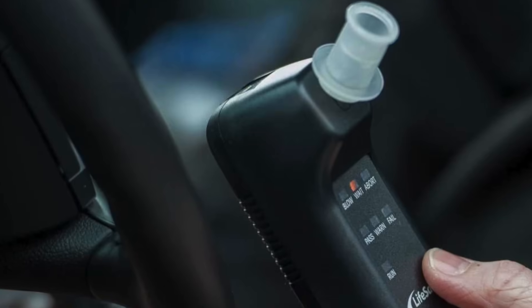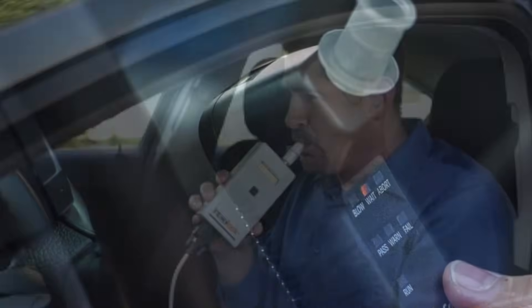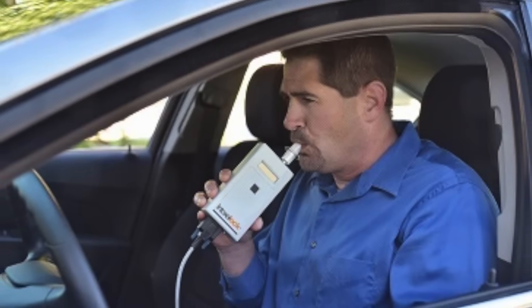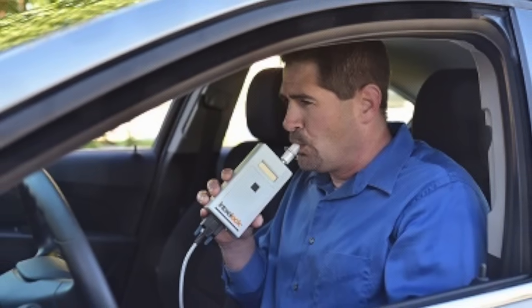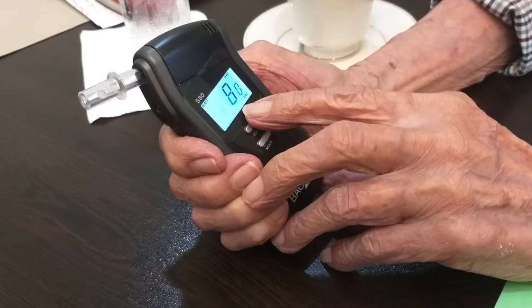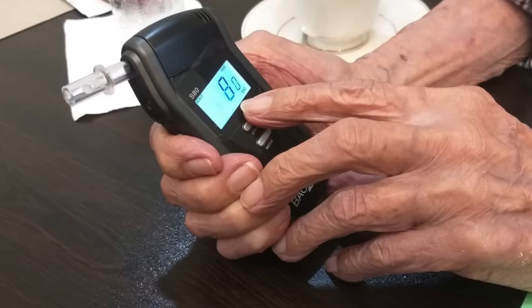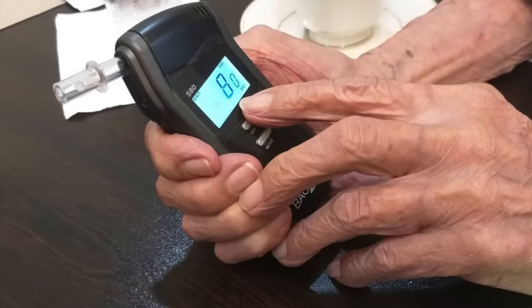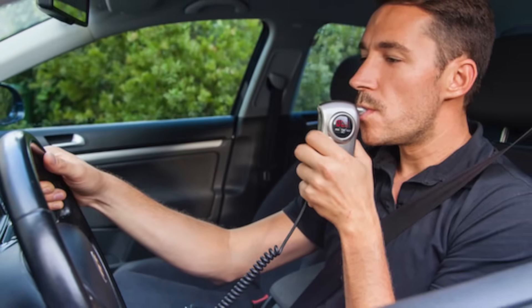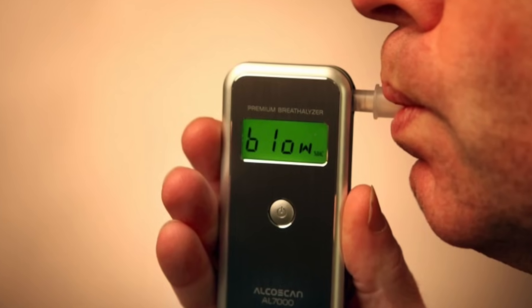Breathalyzers may seem like simple devices, but the science behind them is quite sophisticated. By measuring alcohol levels in your breath and using precise calculations, they provide a fast and effective way to estimate BAC. While not perfect, they play a crucial role in keeping people safe on the roads and in workplaces. So next time you see a breathalyzer in action — whether in a movie or real life — you'll know exactly what's happening inside that little device.